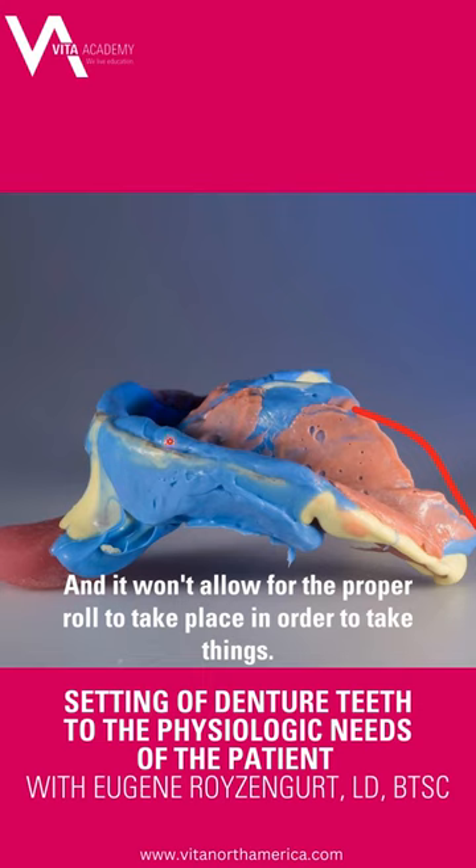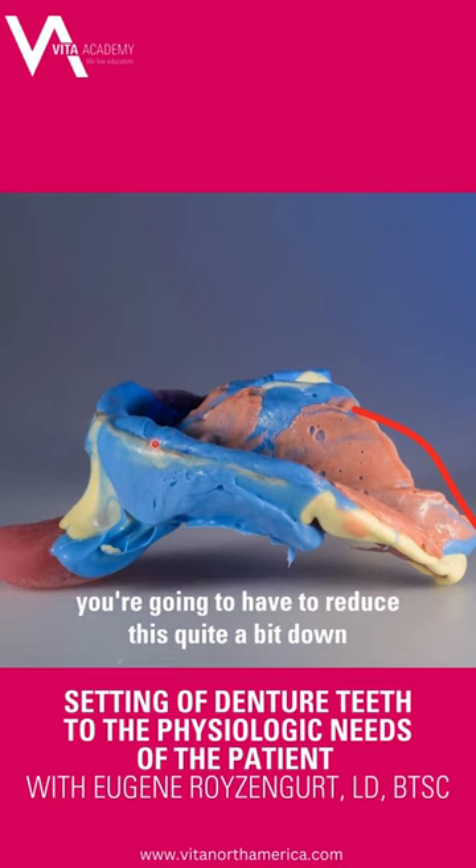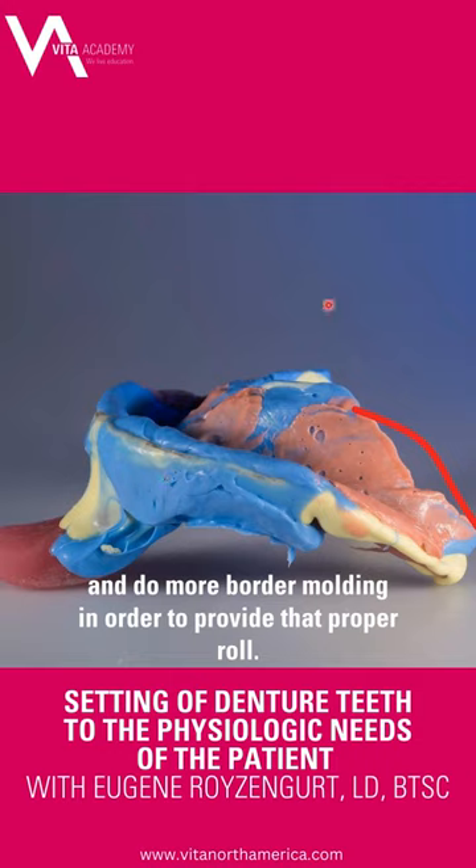It won't allow for the proper roll to take place in order to take things properly. So for this, even if you think you've got enough room, you're going to have to reduce this quite a bit and do more border molding in order to provide that proper roll.